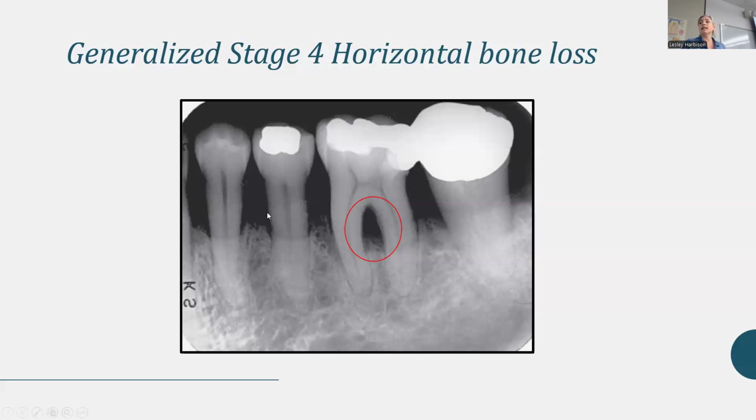Is the bone loss in that first third, or is it into the middle third? If it's into the middle third and below, your mind should go, okay, that's really advanced. Usually it's the early stage that's hard. Figuring out something little is the tricky part, so you just have to practice it more, and there are a lot of opportunities to practice.